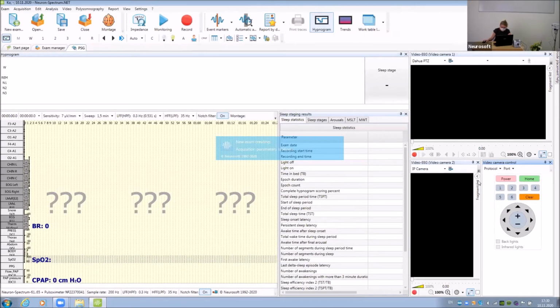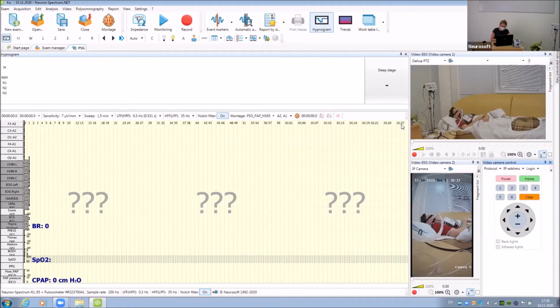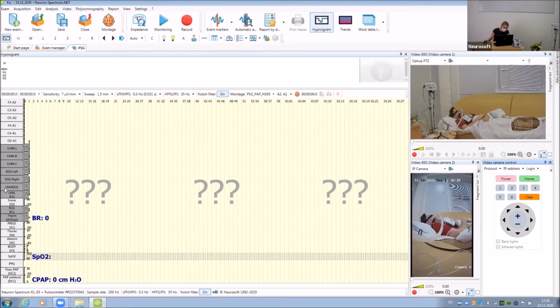So please have a look. We have the same channels, and now we have two new channels. The first channel is called flow PAP, and the second channel is called PAP pressure. So these are two channels, and they are marked with DC1, DC2.